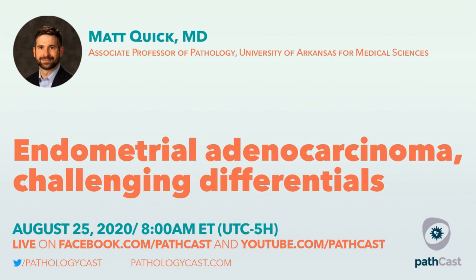But that's not really the question. The question is, what about these complex mucinous lesions? And I think that there's a couple of ways to define complexity. First off, you could have cribriforming complexity. In my opinion, you should treat those mucinous proliferations architecturally the same as you would try to diagnose an EIN or an atypical hyperplasia.